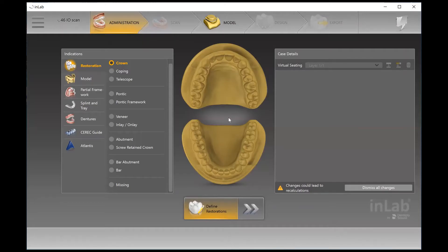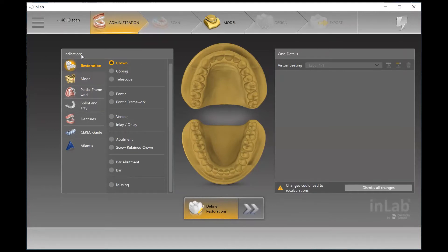Today we are going to look at designing a crown in the InLab software. I'm using InLab Software 20 and I have a 4-6 intraoral scan to do a crown. In the administration phase, under the indications, it defaults to being under restoration and the crown tab.